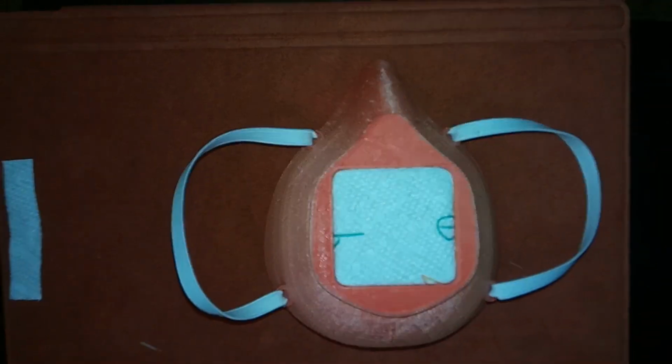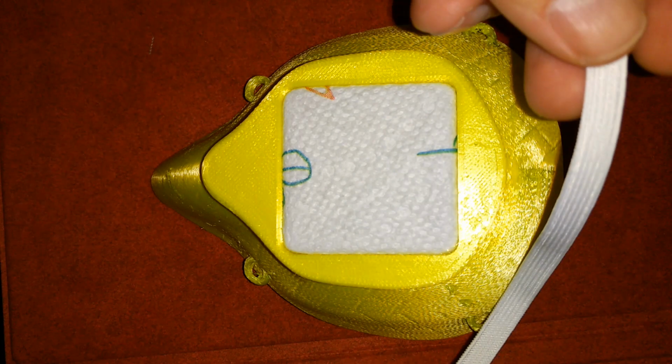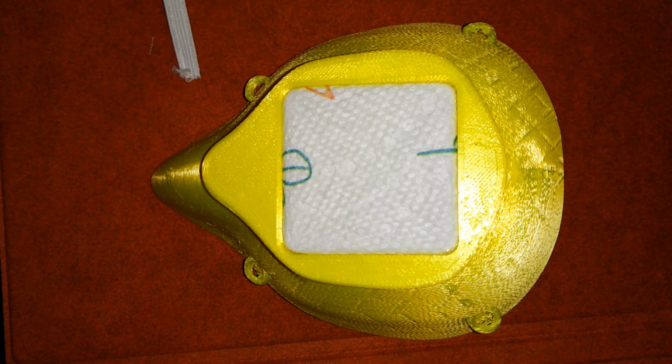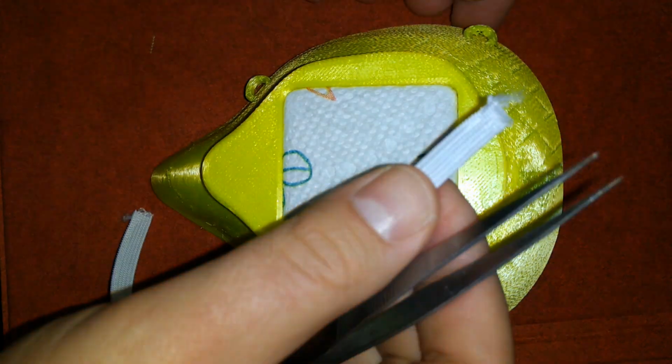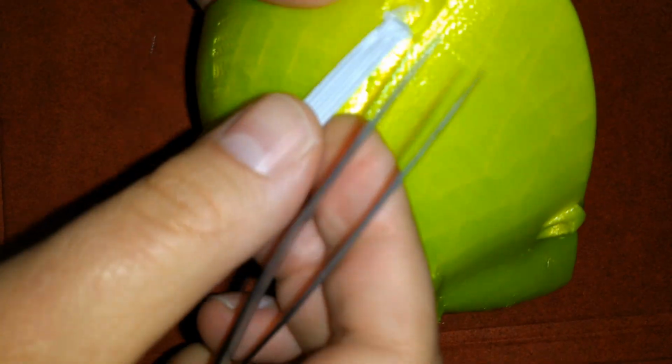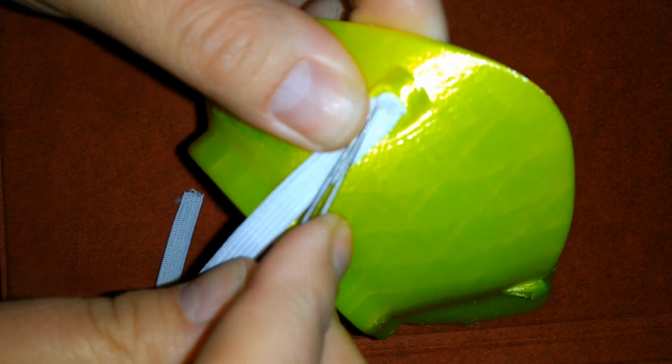And then what you can do for the bands is to use a quarter inch piece of elastic. You can get this from a normal craft store, comes in little packages like this. And what we're going to do is use a pair of forceps to push that elastic piece through those loops. There's four loops, so there's two on each side. So we're going to push it through on one side. And what we're going to ultimately do is form a loop.